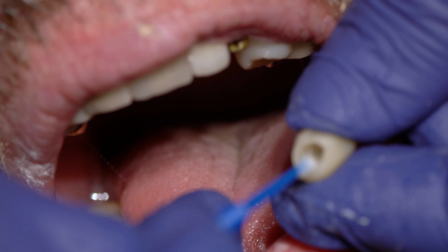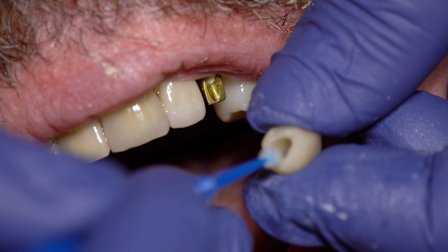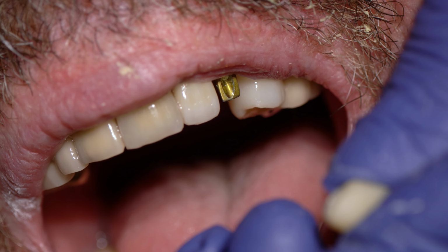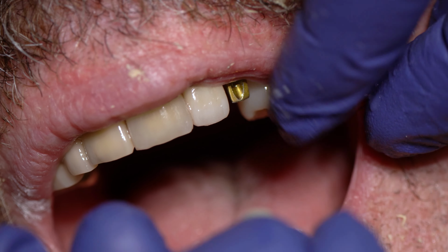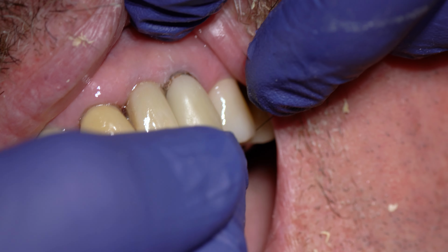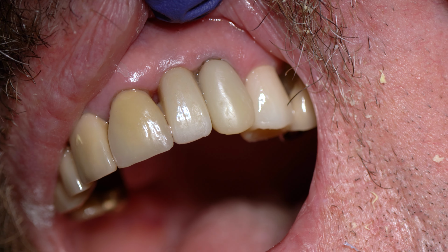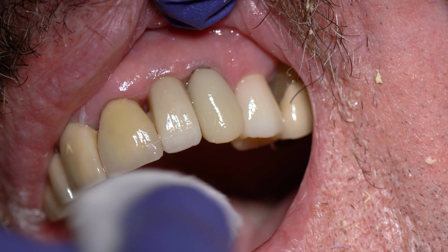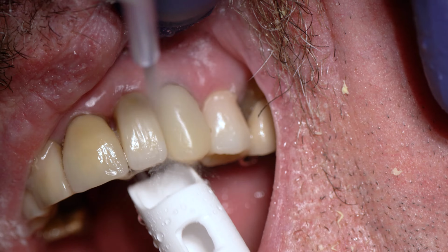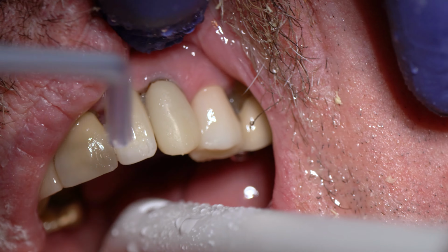Now I'm just polishing this up so it looks decent. I'm going to cement it on with Temp Bond, so that way it's easy to pull off. And that's it. So he gets to go home with this temporary tooth on, and I took an impression already for the lab. I'm sending that back to the lab. They're going to make a new crown. Usually they don't charge you for it. Making a new crown for that tooth right there, and then he gets to go home with two teeth as promised, and he's just coming back for a follow-up to pop this guy off and put the final one on.